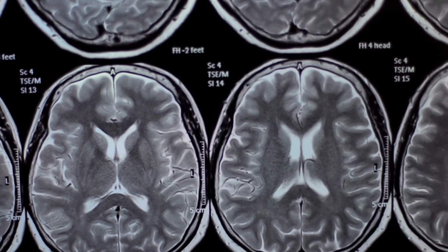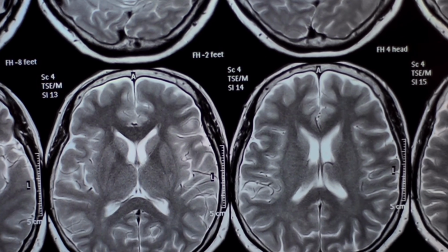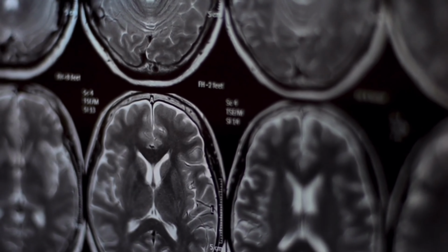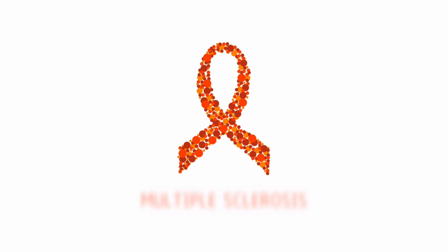DWI scan sequences provide high-definition images of the white matter of the brain and improve delineation when imaging microstructures of the anatomy, which makes it a preferred MRI scan protocol when imaging multiple sclerosis patients.